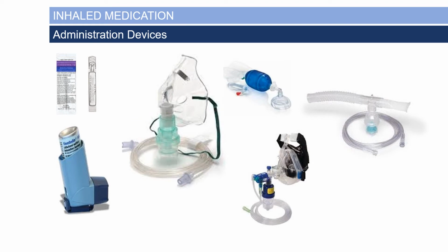We're going to start by going over some of the inhaled medication, and you will see some examples of some devices that we utilize to administer inhaled medication, especially at the time this presentation was made during the period of COVID. We try not to use as many aerosolized medications as possible to avoid unnecessary exposure. One thing that I would like to point out, however, is the bullet that the medication is transported in. If you look at the package, the packaging is pretty clear. It's usually color coded and there is writing in big white letters or black letters. But once those bullets are out of the package, it becomes very difficult to view what the actual medication is. It's embossed in the side of the plastic. So always be very careful to confirm the medication that you're giving.